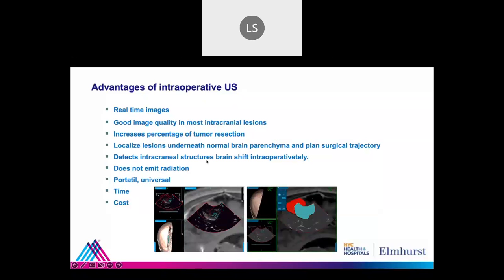It is also radiation free. It's kind of universal. You can find an ultrasound pretty much in every hospital, thanks to the anesthesia team most of the time. The cost is quite low, and it's also very time effective because it doesn't increase the time of the procedure significantly.